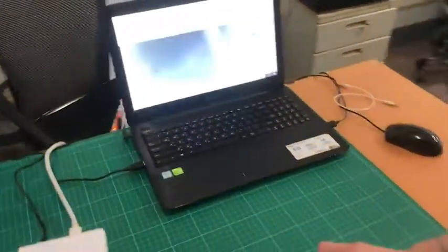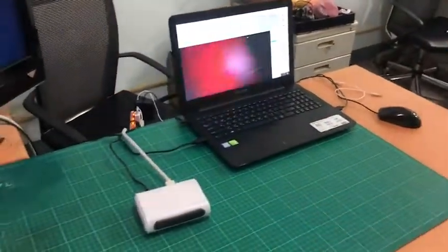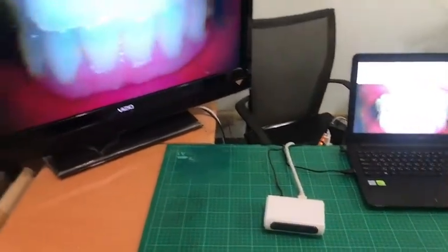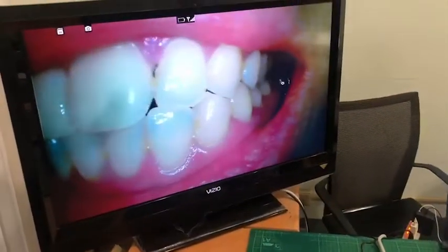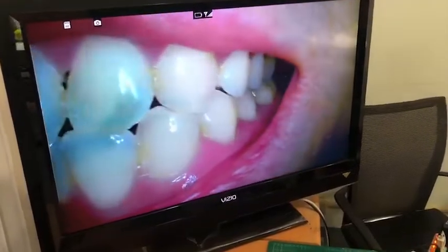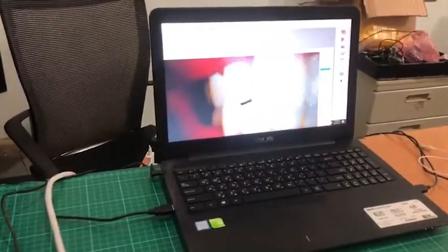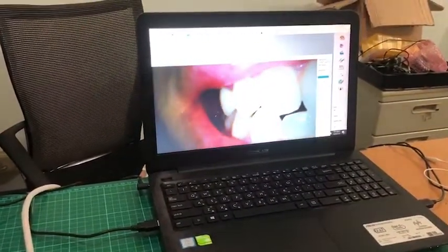Let us show you the quality. You can see that's the Full HD video quality. You can see it on the bigger LCD monitor and PC as well. The PC can work with the PMS system.